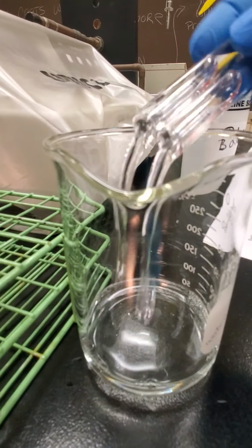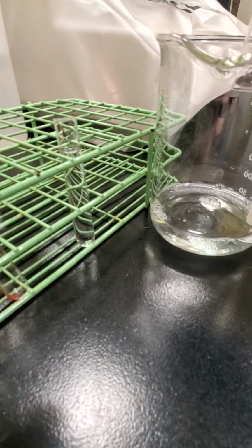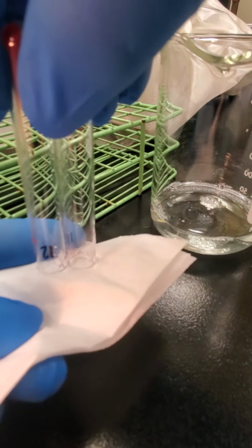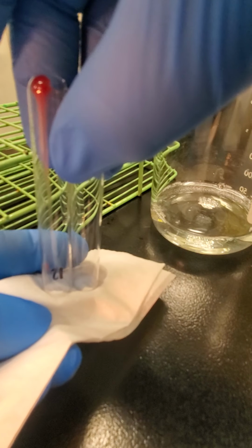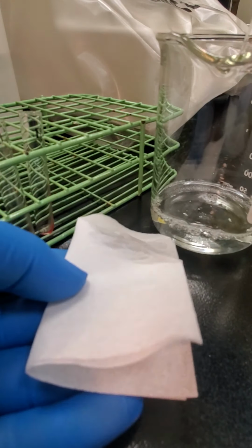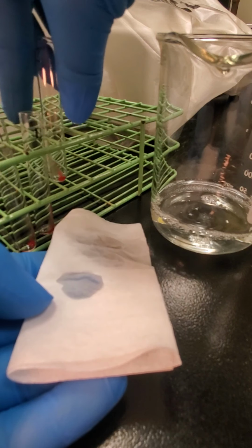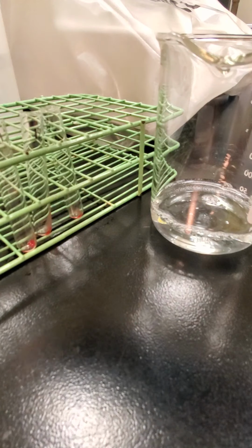I'm going to dump the tubes, leave them inverted, take my Kim wipe and just tap them. So that gets rid of that residual saline. The red cells are still in the bottom. One more. Okay. So my red cells stayed in my tube.